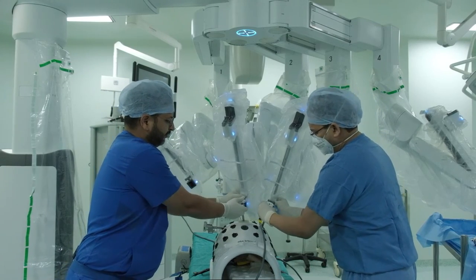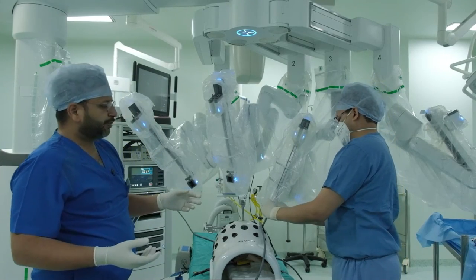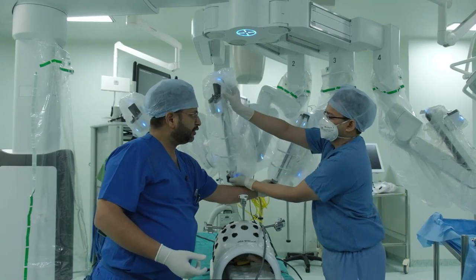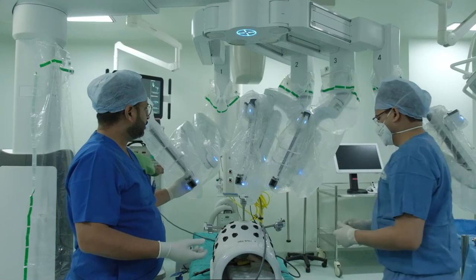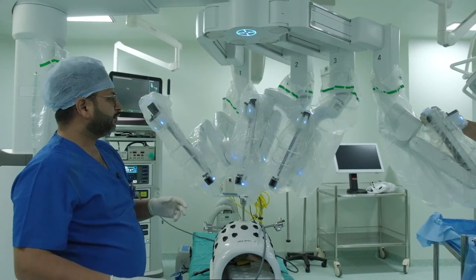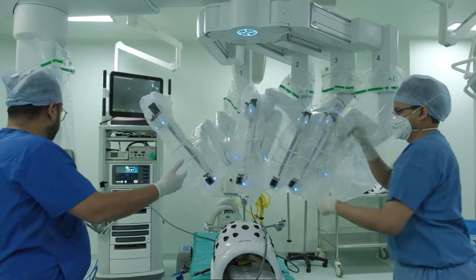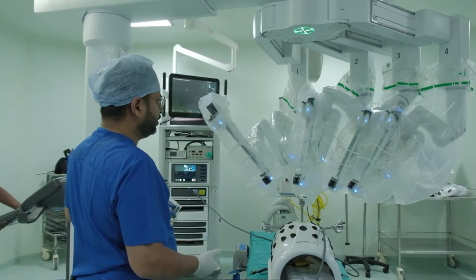Sometimes people have asked us, what happens if you want to convert to laparoscopy? So this is a 1 minute job, not even a single minute. Actually it is a few seconds which is taken to undock. Then we move that arm also, that was stored on this side, and then we ask Mr. Roshan to bring the cart back. Pull the cart back from the patient.